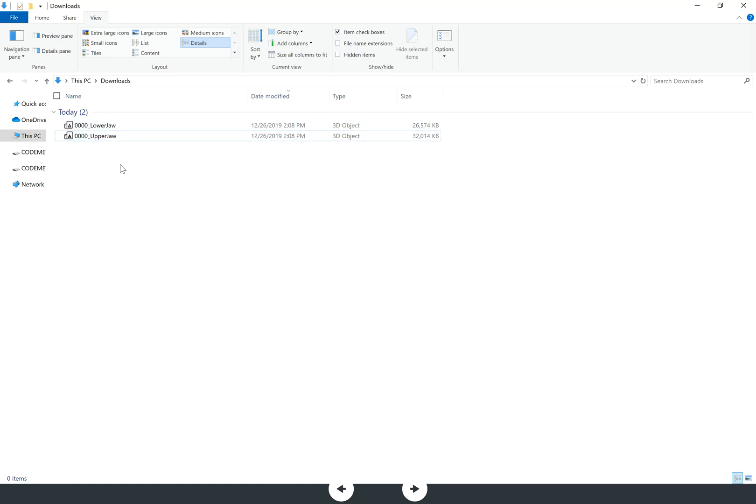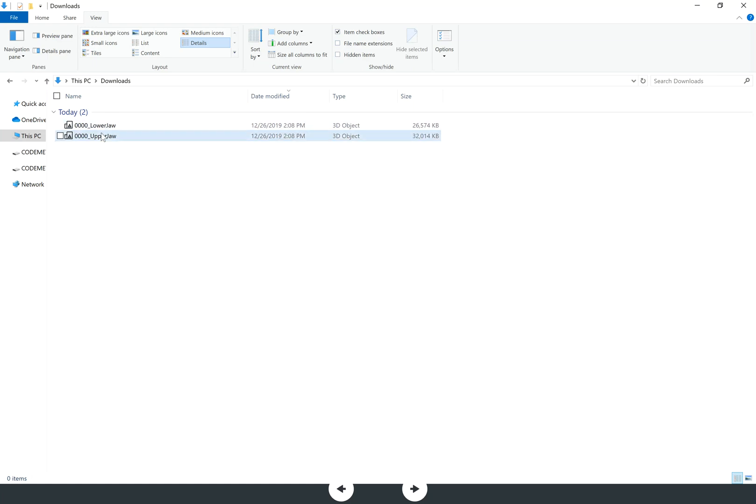There is no third file. A lot of other softwares would give you a bite registration file, not necessary here. The bite registration is automatically built into the upper and the lower jaw, so when you do import these files into a laboratory software or some sort of 3D printing software, the upper and the lower jaw will automatically be articulated.